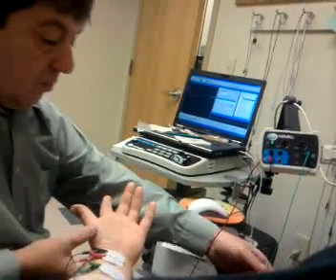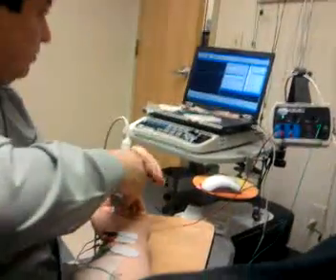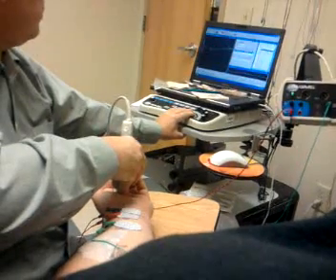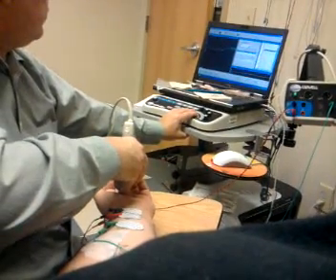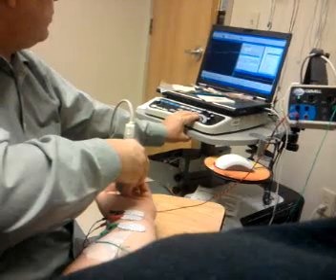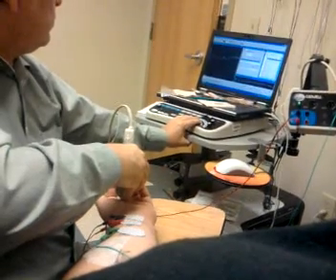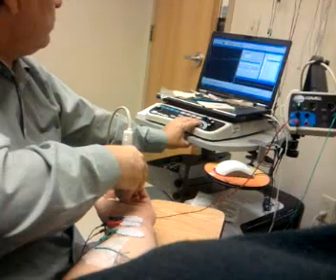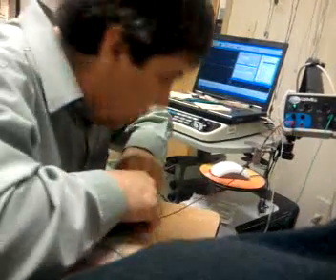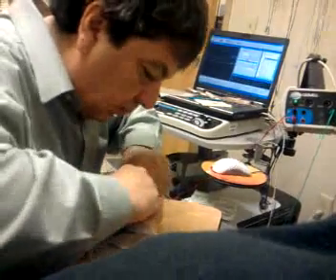On this one, I'm going to move the table over here so you can let your hand go. I've completed that, and now we're going to work on the other side. Do you need to repeat this same process for the other hand? Correct.